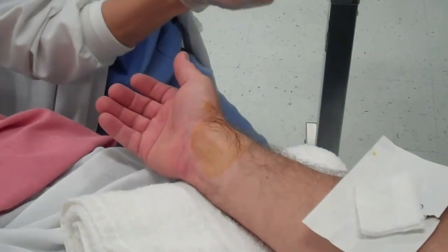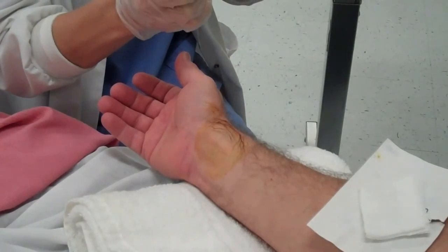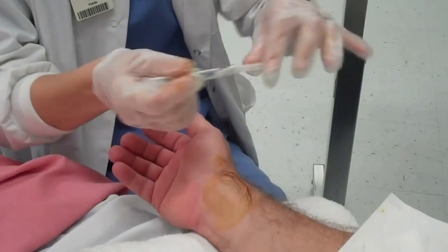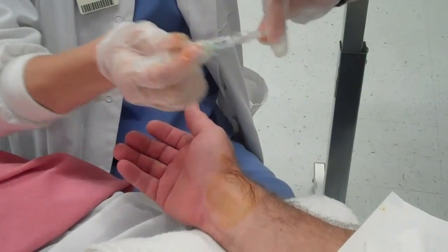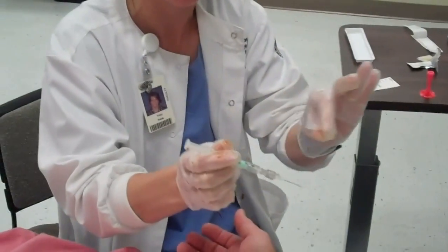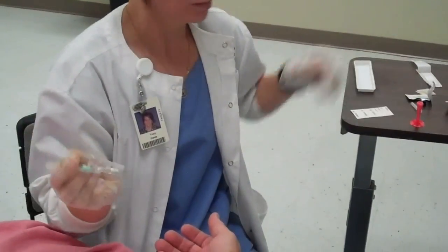Now I'm going to take my cap off. I did recap purposely — I wanted to do that. Whenever you're pulling apart, pull apart this way. Not too closely because you don't want to end up puncturing your hand. So pull apart nicely. I'll put my cap here.